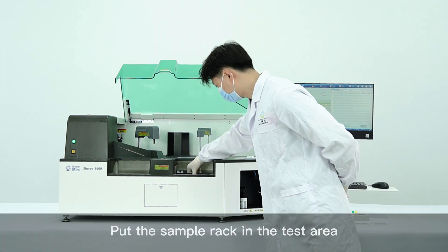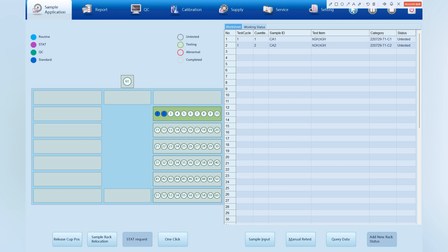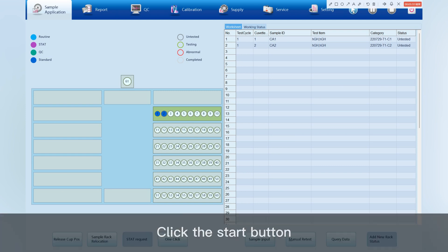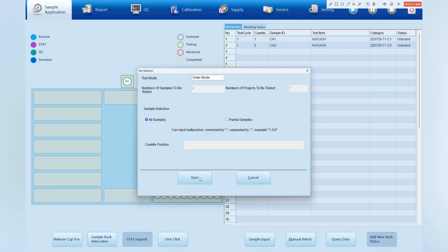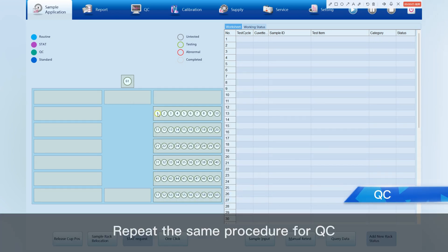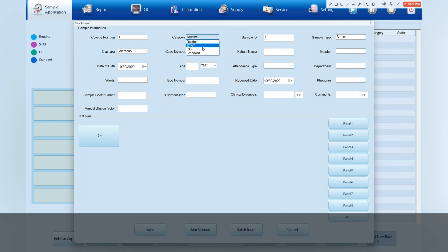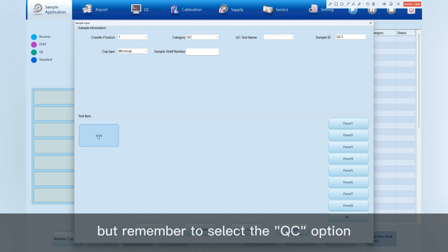Put the sample rack in the test area and click the Start button. Repeat the same procedure for QC, but remember to select the QC option.